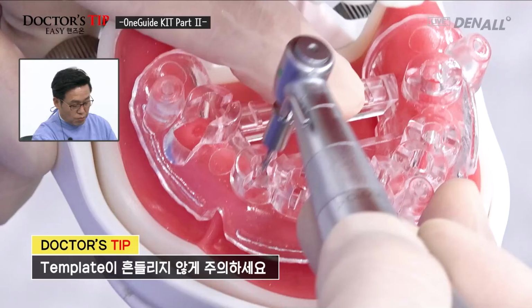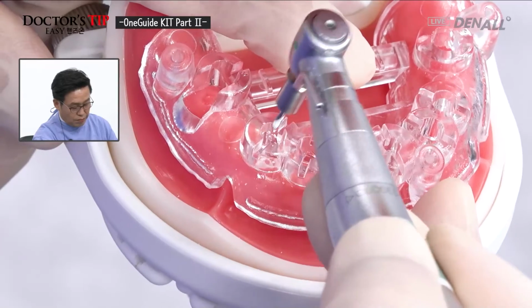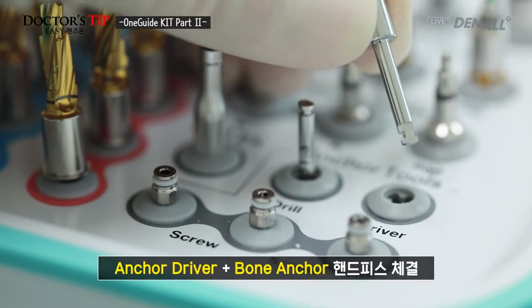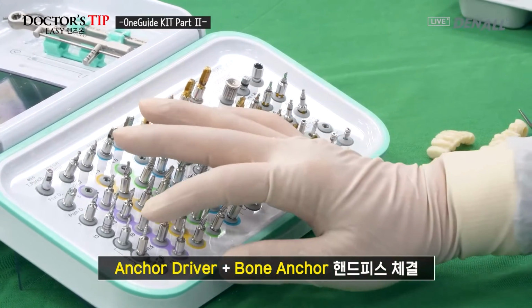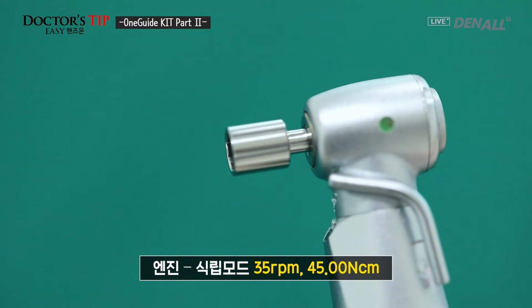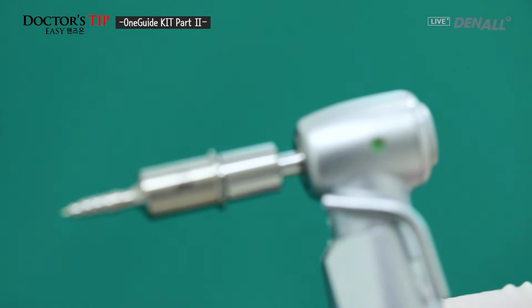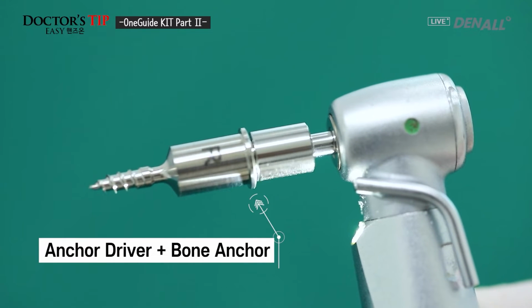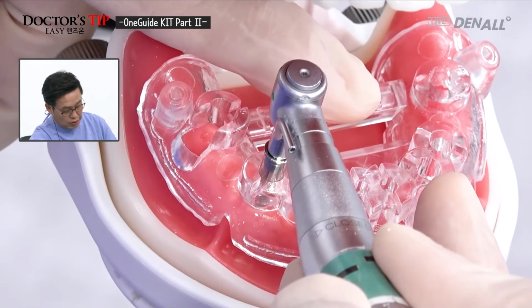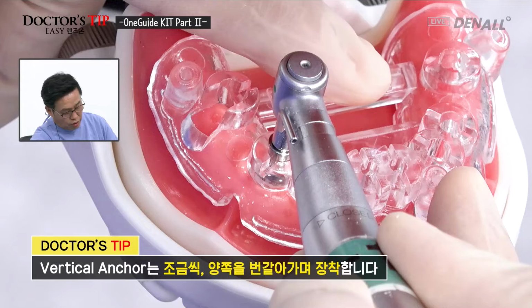Template should not move. First, on number 44, drilling is done. Next, using driver. As you can see, vertical anchor is put in place. Placement mode. If it is drilling mode and it's mounted. The vertical anchor is not mounted to the fullest.